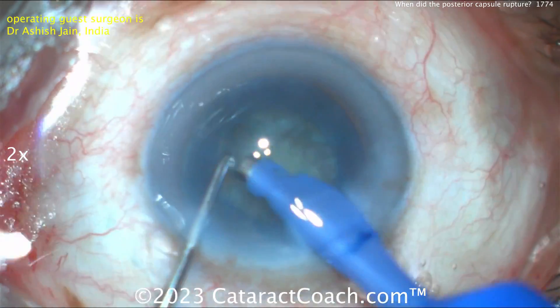Tough case. Remember: when you have an open capsule like this and you've had to do an anterior vitrectomy, you have higher risks — the risk of endophthalmitis is probably increased by a factor of 10, and the risk of cystoid macular edema by a factor of 10. Watch these patients closely in the post-op period. Taking out more material with the vitrector behind the optic. Smart move at the end to use the vitrector for the IA — removal of the viscoelastic — because if you do have any prolapsed vitreous strands, you can aspirate them at the same time. Tough case. Go back, slow down the video — YouTube's settings button lets you watch in slow motion — and tell me where did that capsule break?